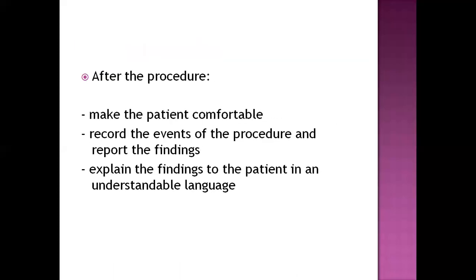And after the procedure, again, making the patient comfortable is the first priority. After that, recording each and every event that occurred during procedure and making a report of findings of that procedure. After that, explaining the findings to patient in a simple language so that patient can understand his condition, and also understand how to start treating the condition. So explanation should be as simple as possible.